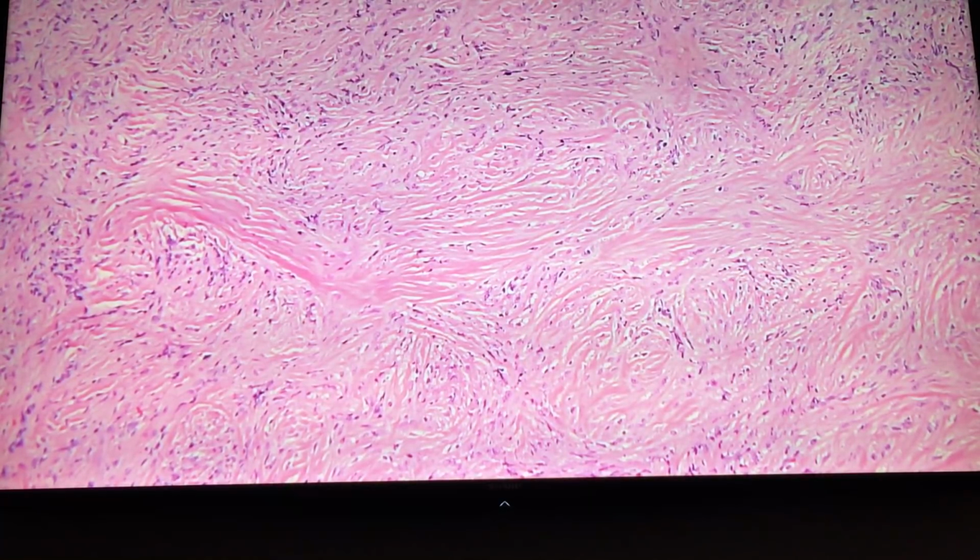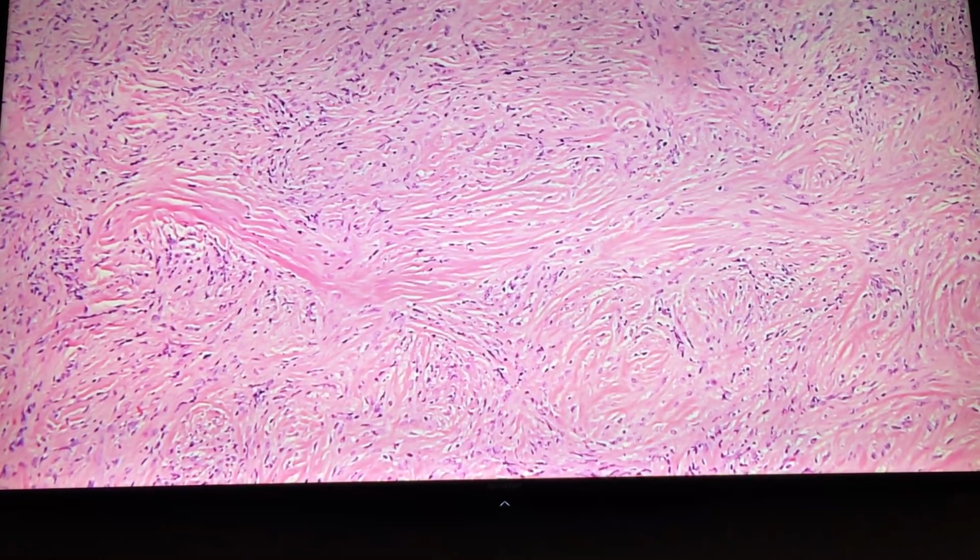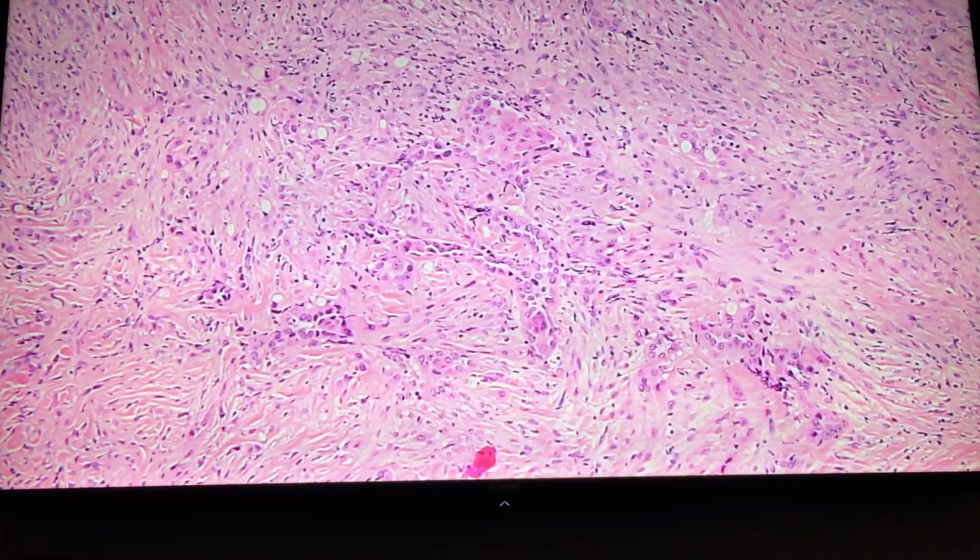So is this benign or malignant, this stuff here? Benign, like fibrosis? Yeah, there's something in the background. Yeah, this stuff's very fibrosing, isn't it? So is that what is happening? There's a fibrosing process, and then there is also a malignancy? Or is it malignant or benign? I think I saw some malignant glands. Show them if there's anything that looks malignant.